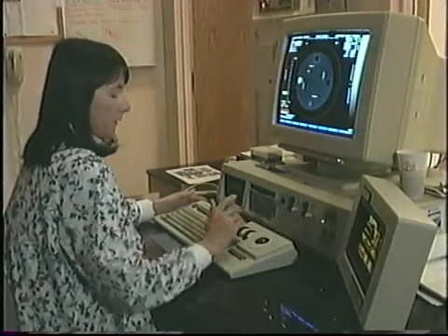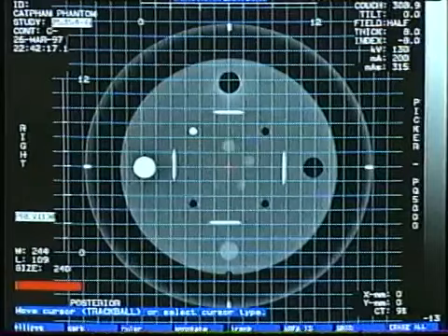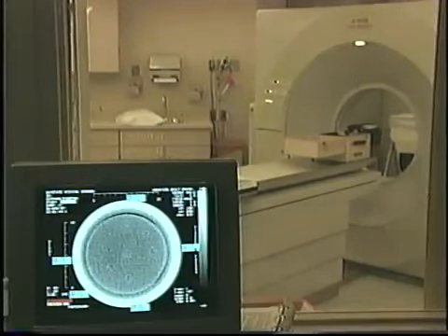Verify the X and Y alignment by the Phantom's position in the center of the screen. The scanner's grid selection feature will assist you in viewing these axes. Incorrect alignment may indicate the need to recalibrate the alignment lights or the scout view accuracy.